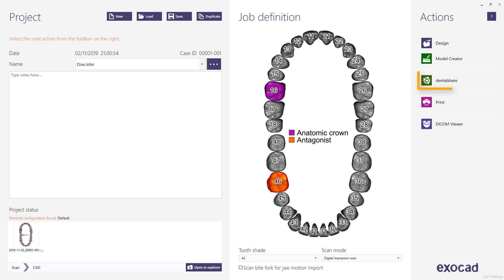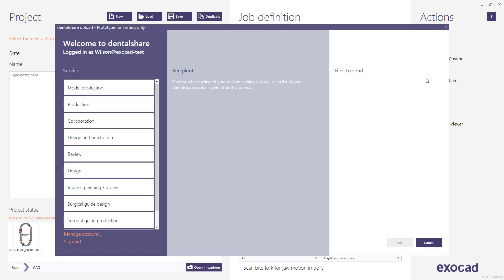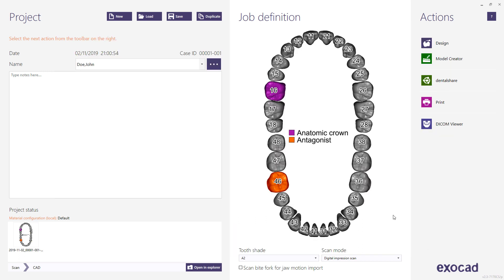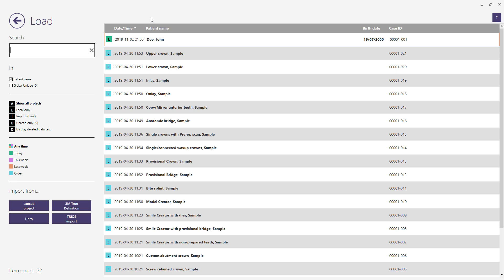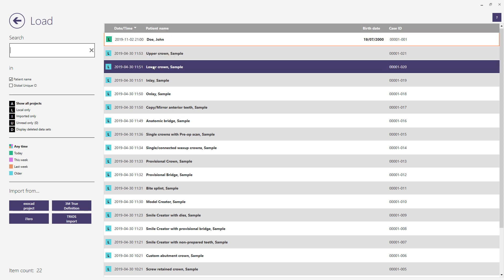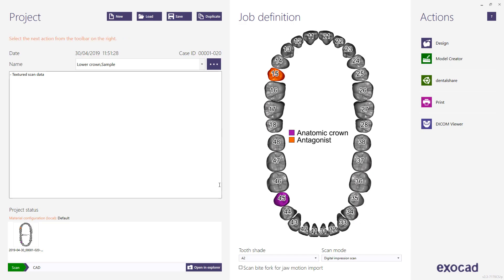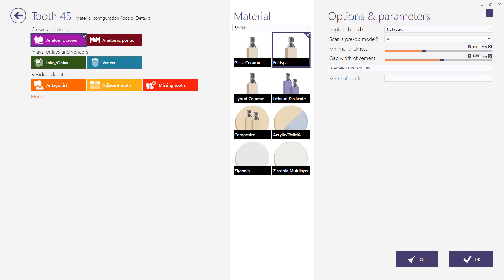You can collaborate with other DentalShare users to request a specific service and to transfer project data. We will proceed with one of our demo samples. Click on the load button at the top of the ChairsideDB window and choose the demo sample called lower crown sample, then click on the load button again. The restoration type selected for this case is anatomical crown and feldspar as the material.